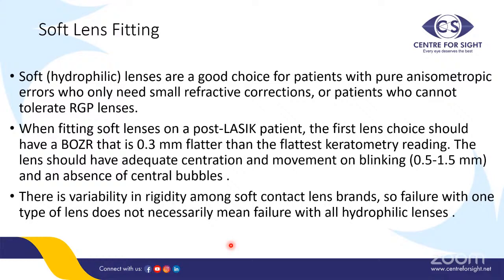There is a variability in rigidity among soft contact lens brands. So that means if one contact lens does not fit the patient, that does not mean all contact lenses may fail. You have to try different brands and different materials of soft lenses, provided they are all hydrophilic lenses.